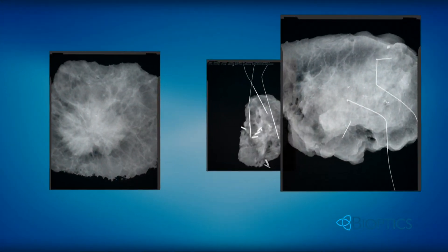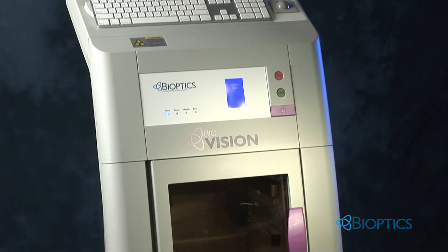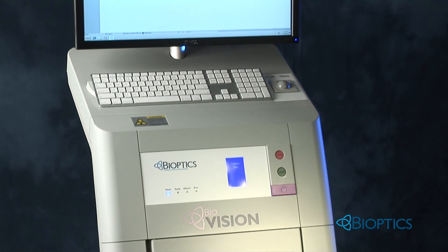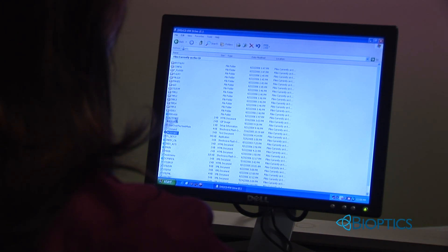The result? The best image quality in the industry. Bioptics BioVision is very intuitive and can be used by operating room personnel with minimal training. Patient information is uploaded easily from the scheduling work list on the PACS.